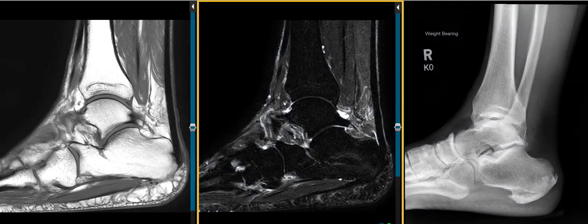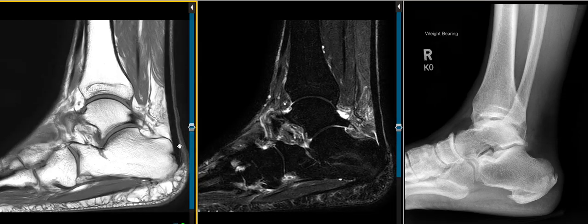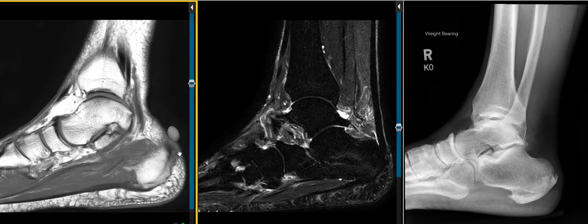Hello, this is Dr. Gay from First Look MRI, and this is a 73-year-old male with complaints of heel pain. They have a marker over their heel, and it's just a quick case of common findings.